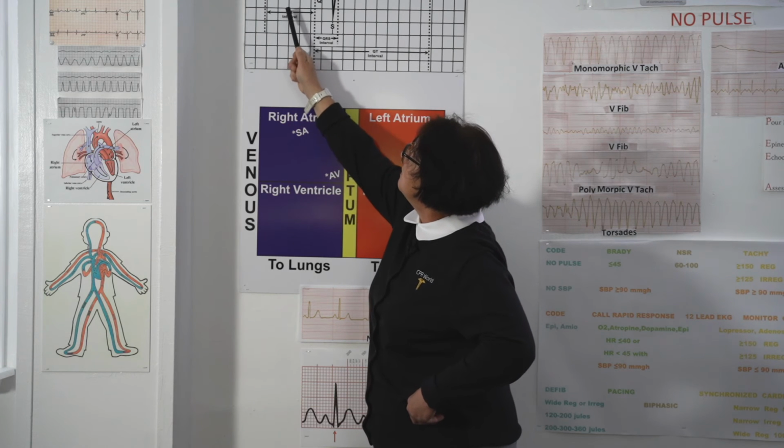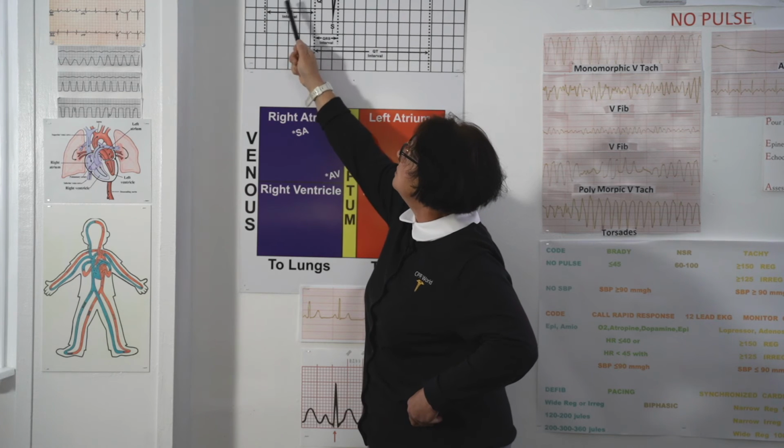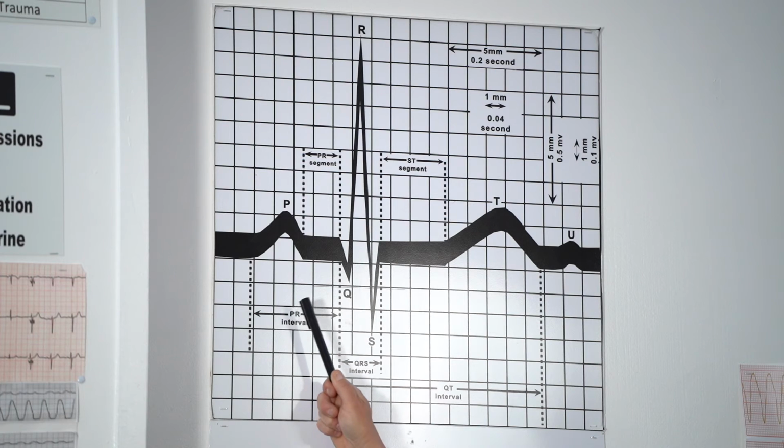So the P wave is not very impressive on paper because it's not very impressive of a contraction. This is when your atriums contract together, 15 to 30% of cardiac output. You can't even feel a P wave. You can only hear it with your stethoscope.